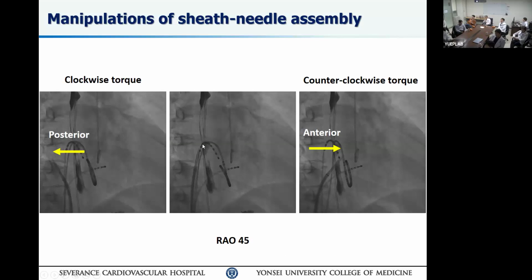as I said earlier, some people have distorted cardiac anatomy, or there are situations in which there is RA enlargement or pericardial effusion. So in this RAO view, those cardiac contours might be less deceiving if you puncture in this configuration.